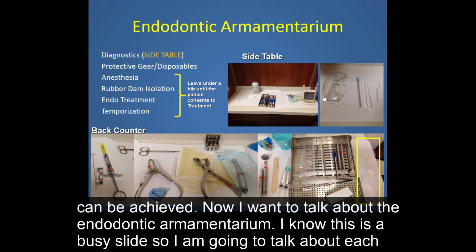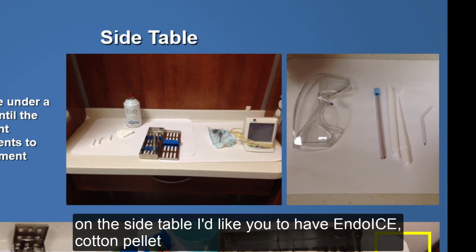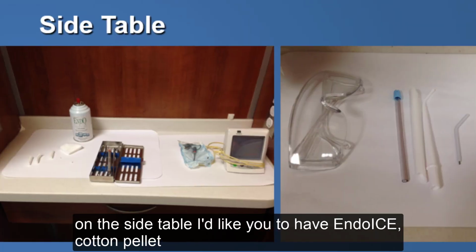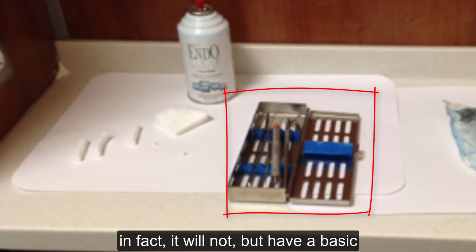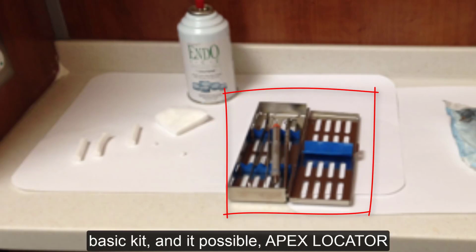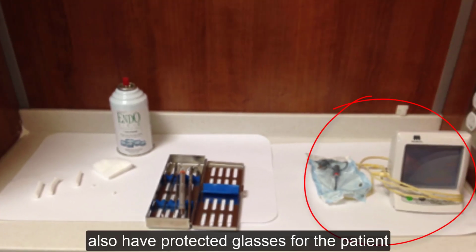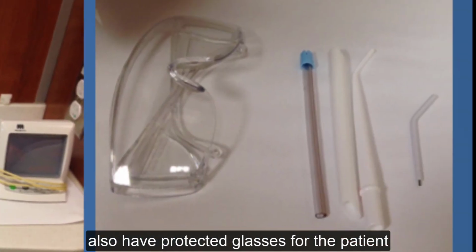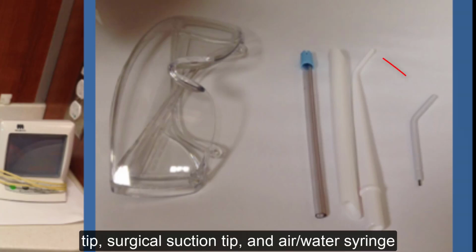Now I want to talk about the endodontic armamentarium. I know this is a busy slide, so I'm going to talk about each thing. This is how I would like all of the operatories to be set up before a patient is seated. On the side table, I'd like you to have endo ice, cotton pellets, cotton rolls, a basic kit. It may not look just like this. In fact, it will not, but have a basic kit. And if possible, an apex locator with the lip clip and file clip. Also have protective glasses for the patient, saliva ejector, high-speed suction tip, surgical suction tip, and air water syringe.